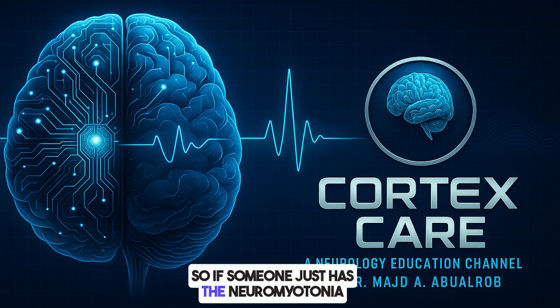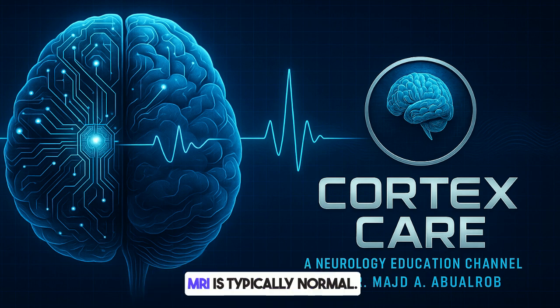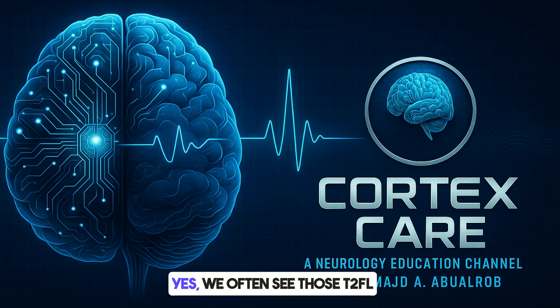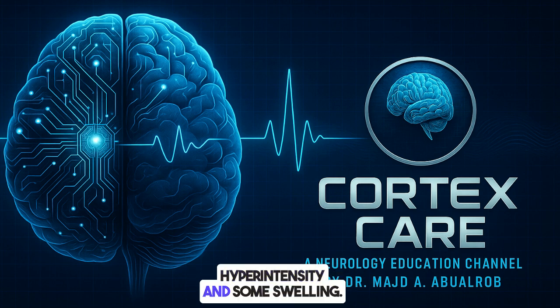So if someone just has the neuromyotonia or Morvan syndrome, is the MRI normal? Usually, yes. If it's just the peripheral nerve or autonomic symptoms, the brain MRI is typically normal. Okay. But in CASPR2 patients who have limbic encephalitis, then yes, we often see those T2-FLAIR signal increases in the medial temporal lobes, much like in LGI1. Figure 3 shows that nicely, left medial temporal hyperintensity and some swelling.